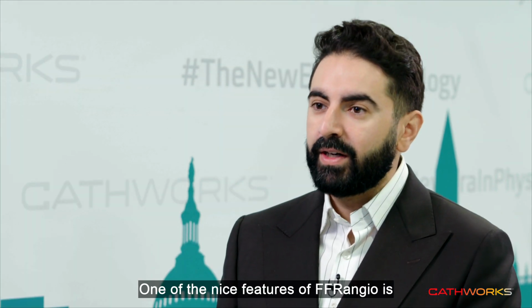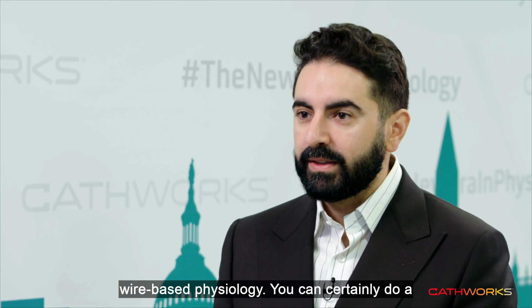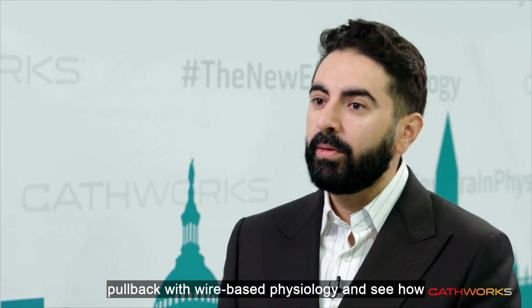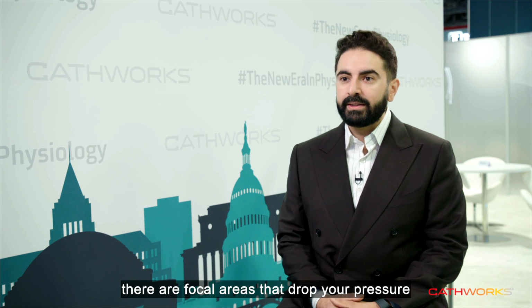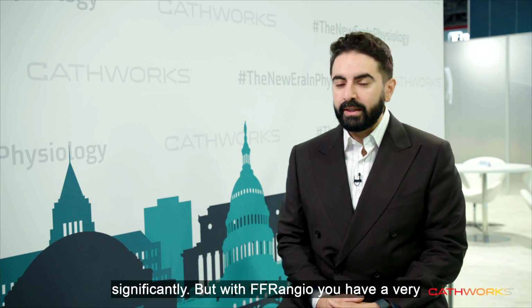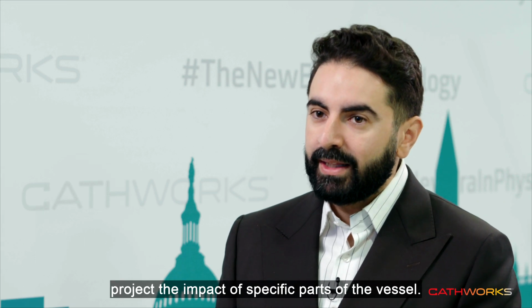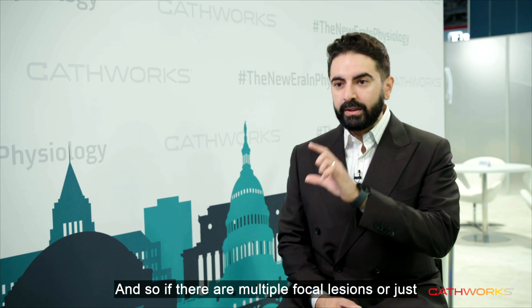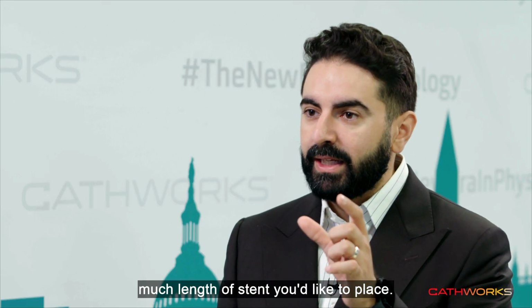Is very helpful. One of the nice features of FFR angio is the lesion impact factor, which you don't get with wire-based physiology. You can certainly do a pullback with wire-based physiology and see how diffuse the lesion might be, see if there are focal areas that drop your pressure significantly. But with FFR angio, you have a very unique tool that allows you to project the impact of specific parts of the vessel. And so if there are multiple focal lesions or just one diffuse lesion, you can really determine how much length of stent you'd like to place.